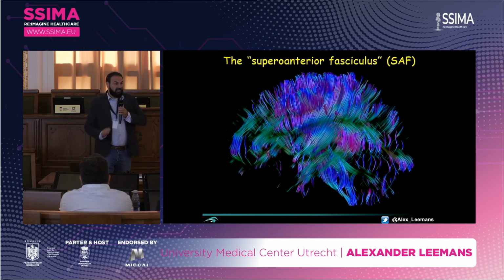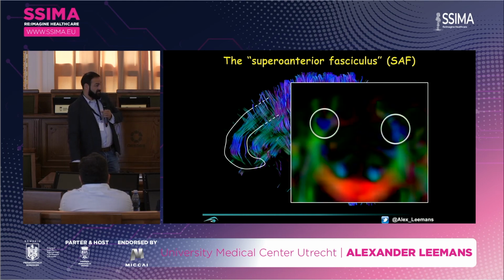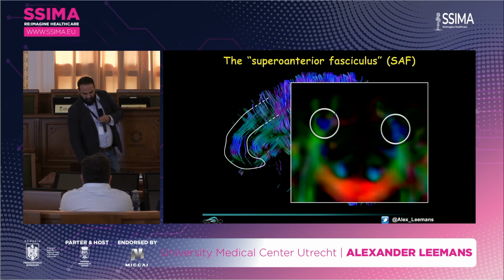I could also say, let's only keep those pathways that have something going up-down as the dominant orientation. Okay? And again, you could see this kind of pathway popping up. And if you look at the conventional diffusion color-encoded maps, you could already see the blue dots here. So that would be over here, this cross-section here. And here it would be the dominant population within a voxel showcasing the blue orientation.